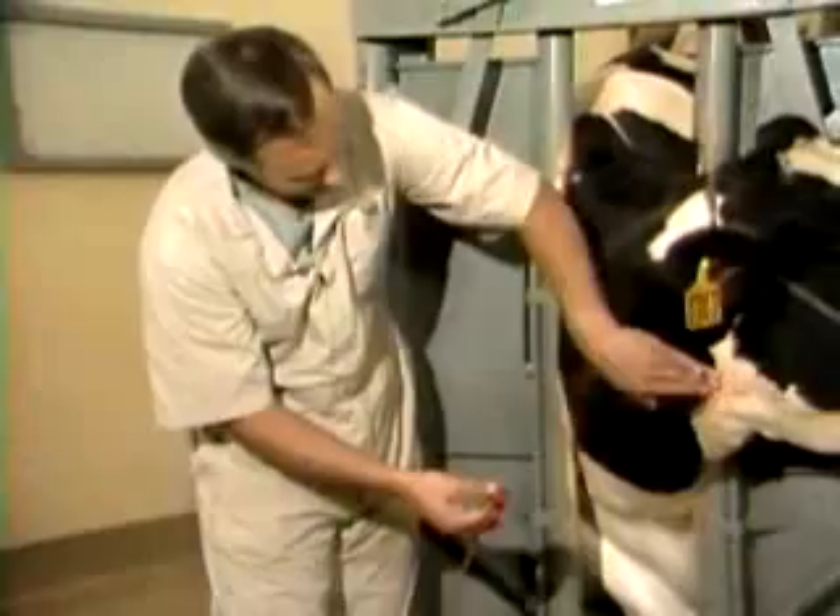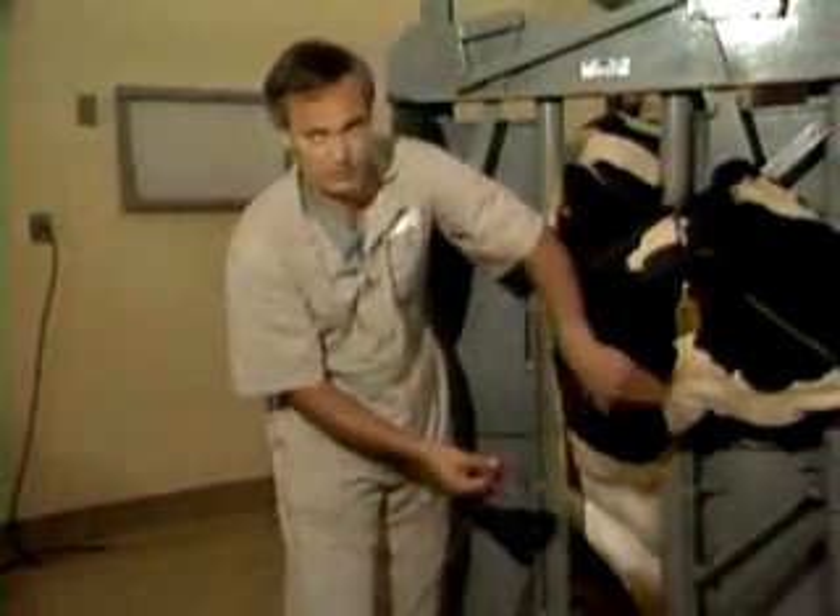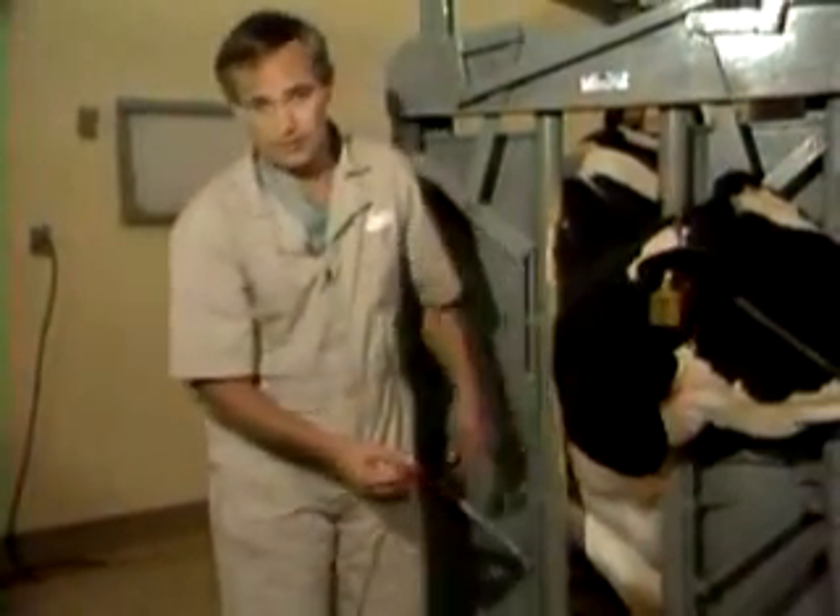When we're finished with the administration, give it a quick thrust to pull it out, and then always rub the vein out very well to make sure she doesn't have some leakage and a paravascular hematoma.